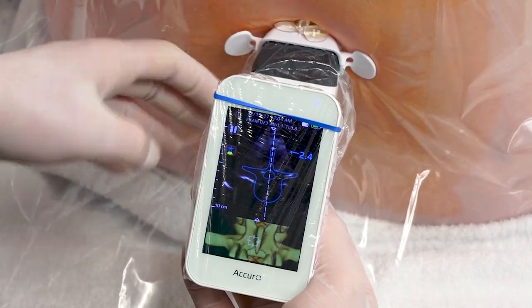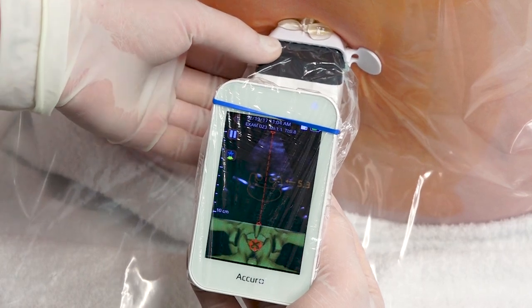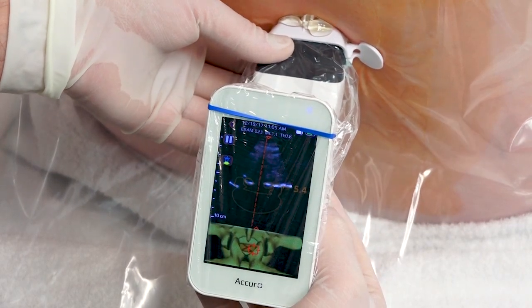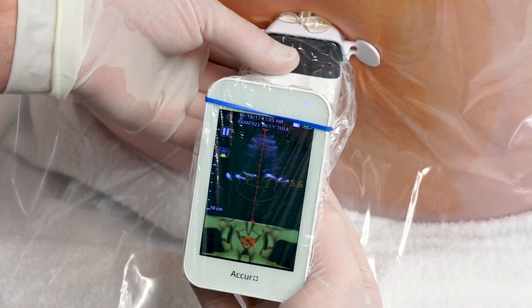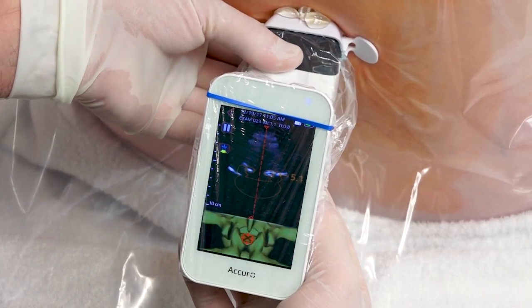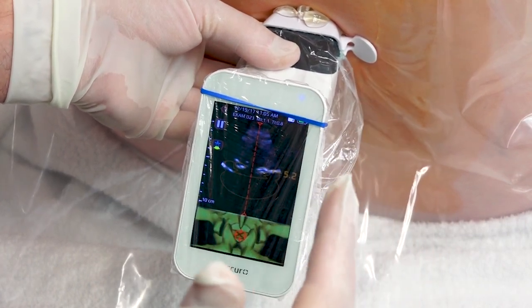In order to have a clean entry point, you want to get rid of that spinous process. Try to move your ultrasound up and down until you don't see that little dot that represents the spinous process — this will be a good interspace. It's very important to keep in mind the trajectory of the ultrasound beam and to remember the angle at which you obtain this image.